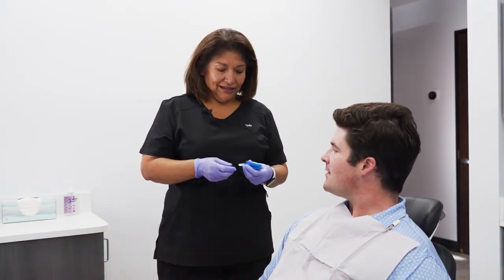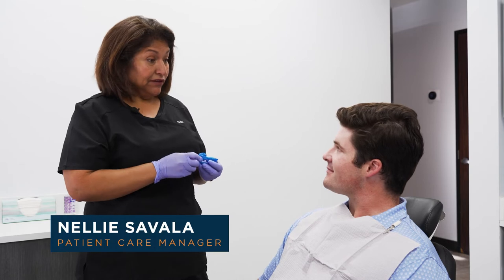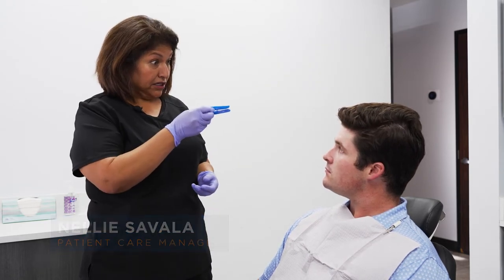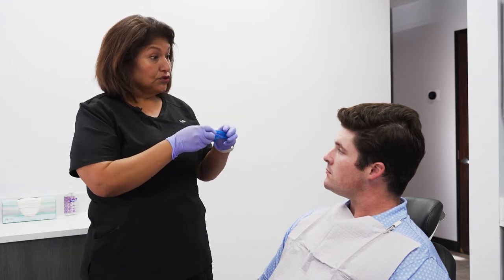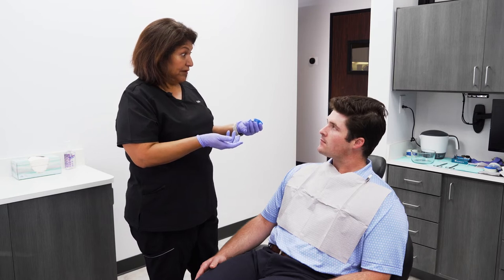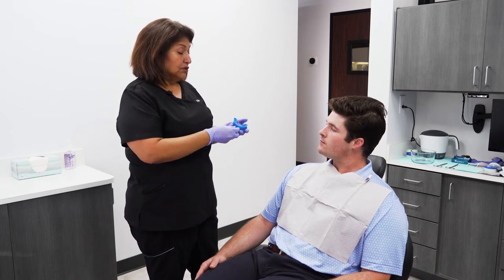Hello, Garrison. We're going to get started in fitting you to your new FlexTap. It's going to be a two-section device that's going to hold your jaw forward, opening up your airway, helping you sleep and feel better. So what we're going to do is get started here.